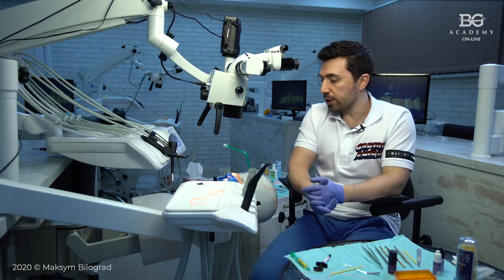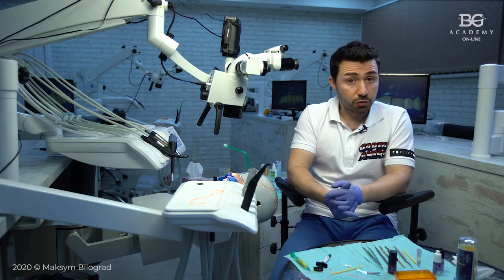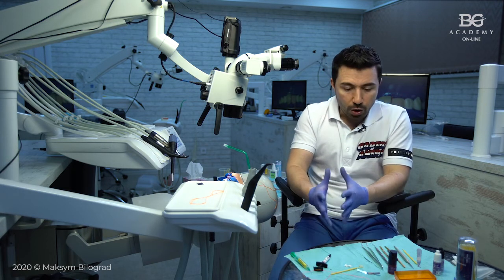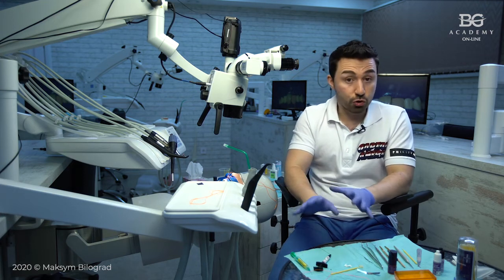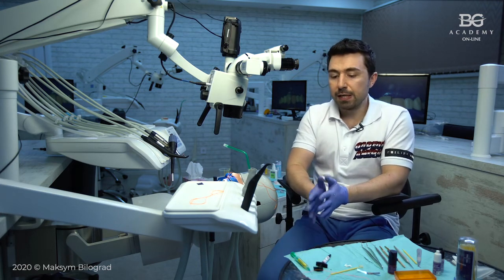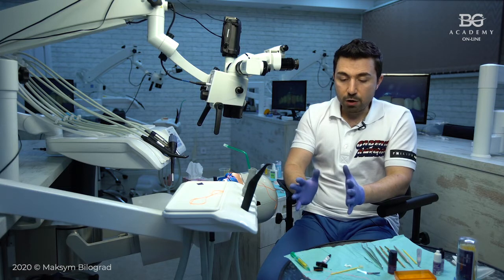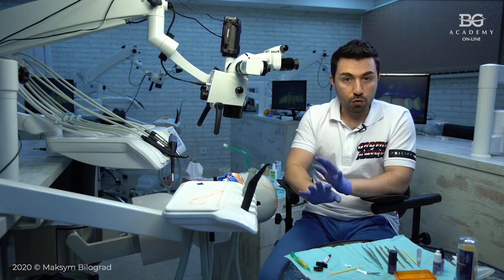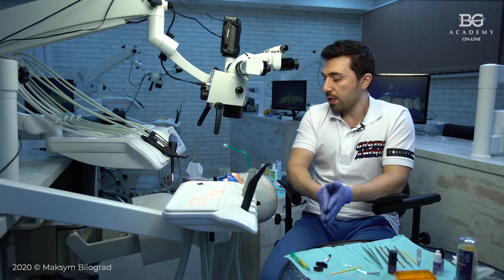In the rest of the cases, you may get good integration of your ceramic veneer with the tooth. Respecting the bonding protocol, you will get a really good long-term survival rate for your veneers. And don't be afraid, they can be bonded for a long term, for many years.